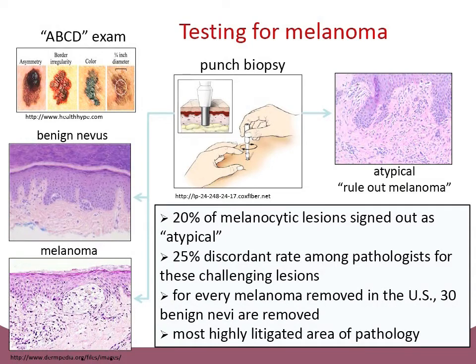And then lastly, this wasn't part of the beta, but I wanted to bring it up because one of the questions that comes up is, okay, we've looked at V1 and V2 from OncoScan. How does it compare to V3? And so we had also done studies on V1 and V2, and so we were able to come back to those samples and run them on V3. But let me at least just tell you quickly about one of the studies that we did on V1, and it was looking at using this platform to distinguish melanocytic lesions of uncertain potential from true melanoma.